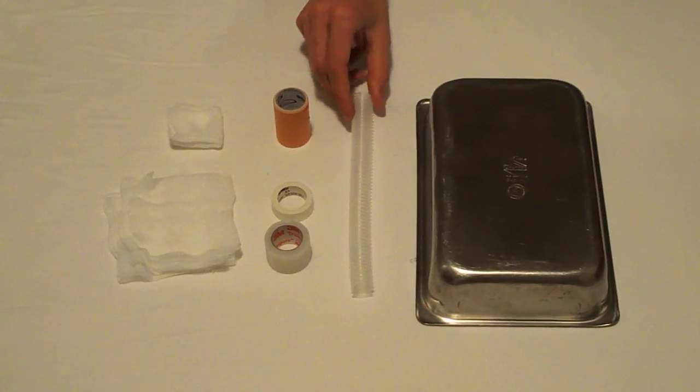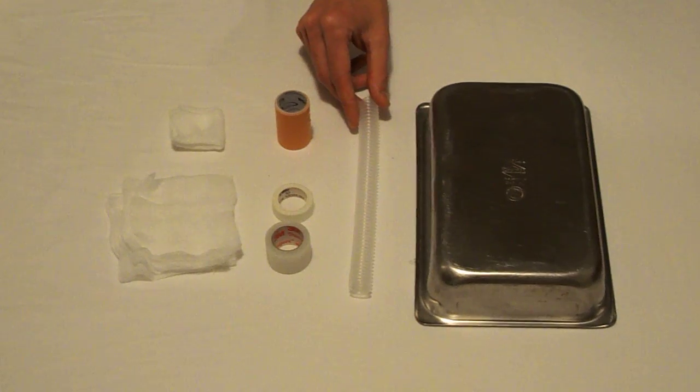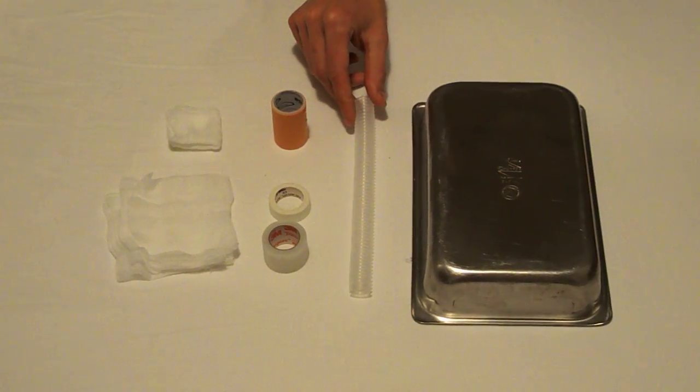You'll also need a trachea. Ventilator tubing is ideal for this. The double thick ventilator tubing is best but you could also use the single thick.